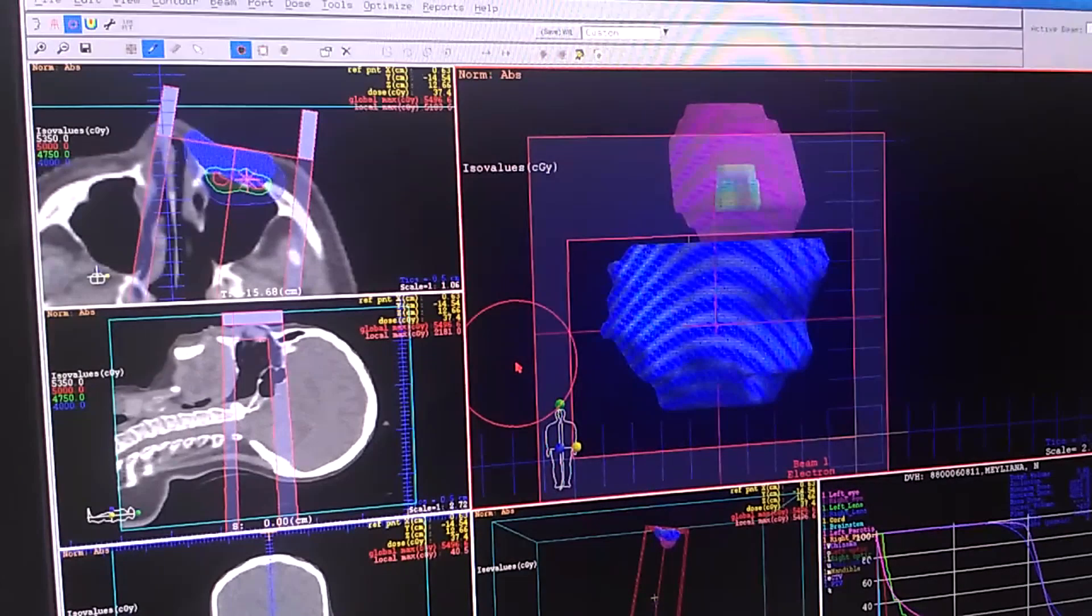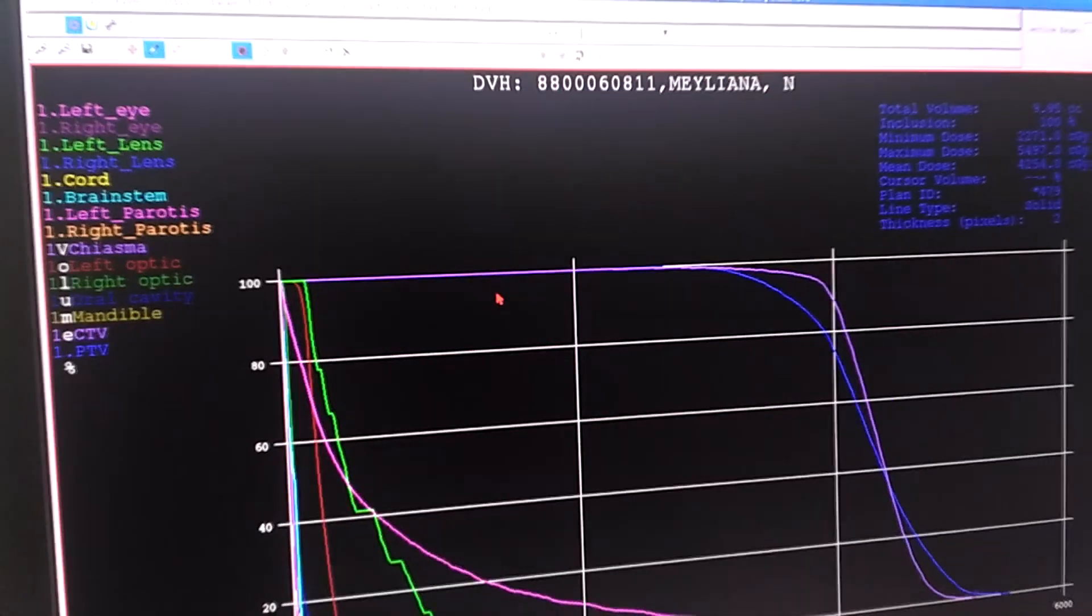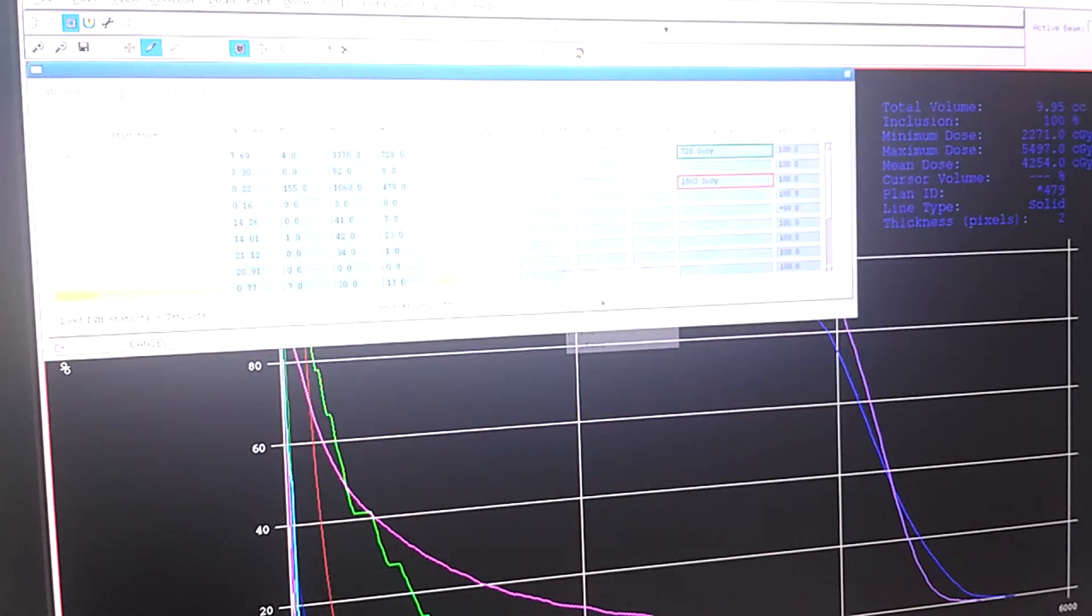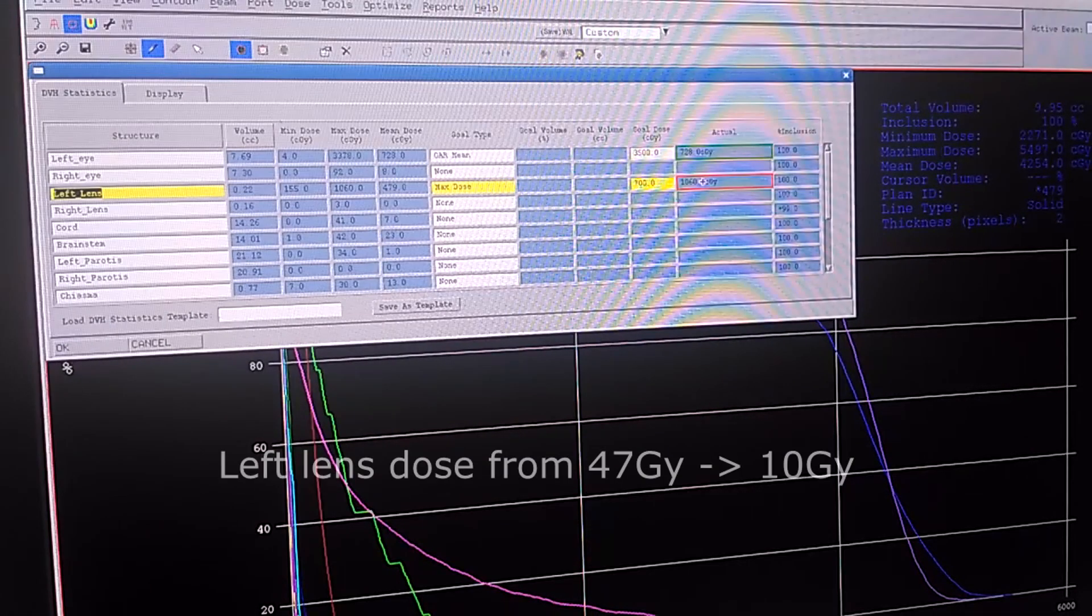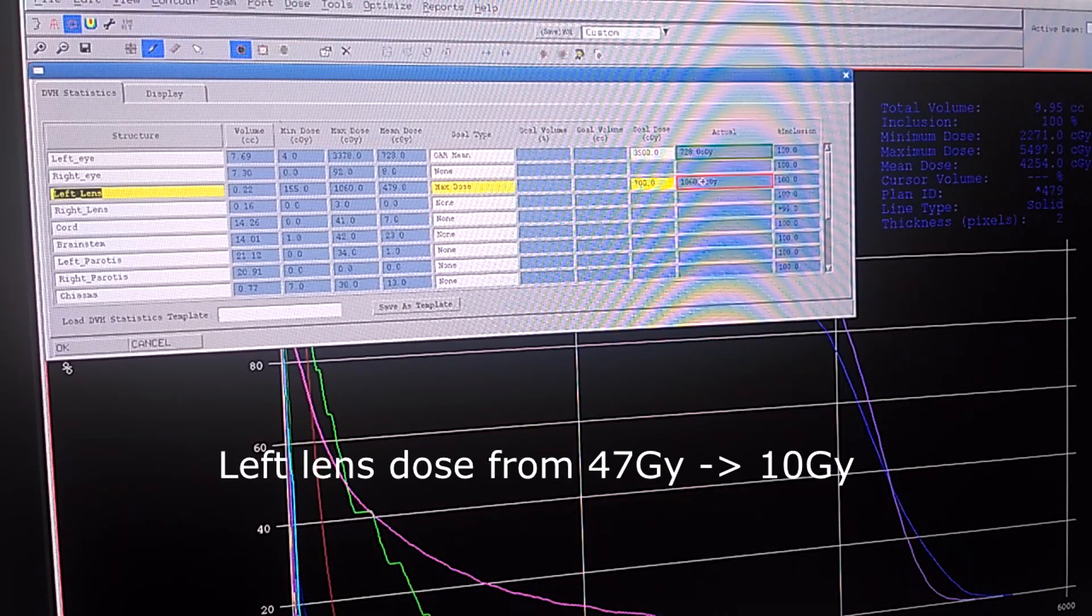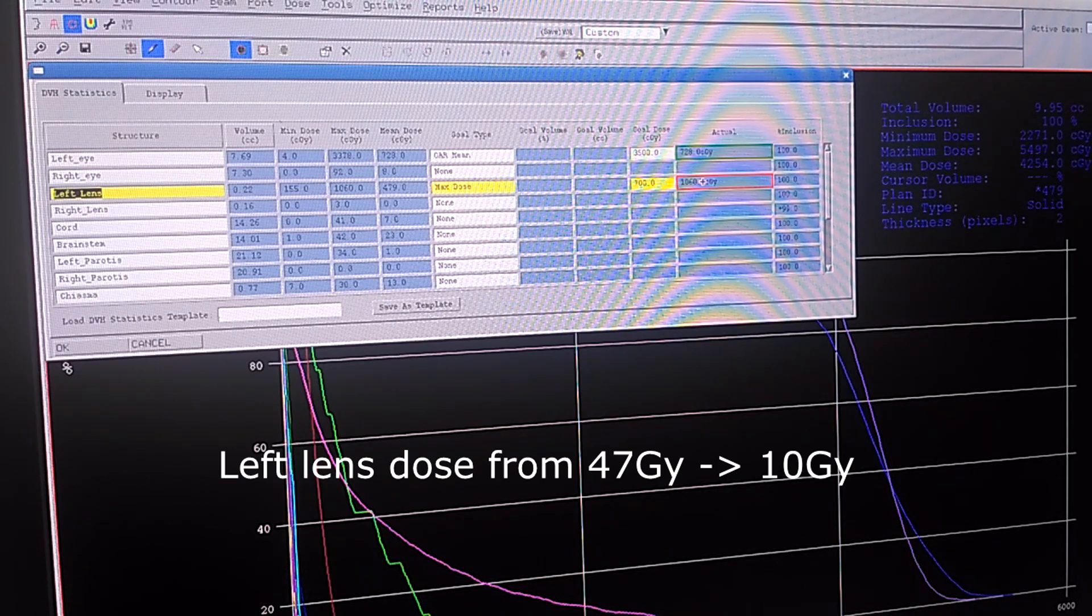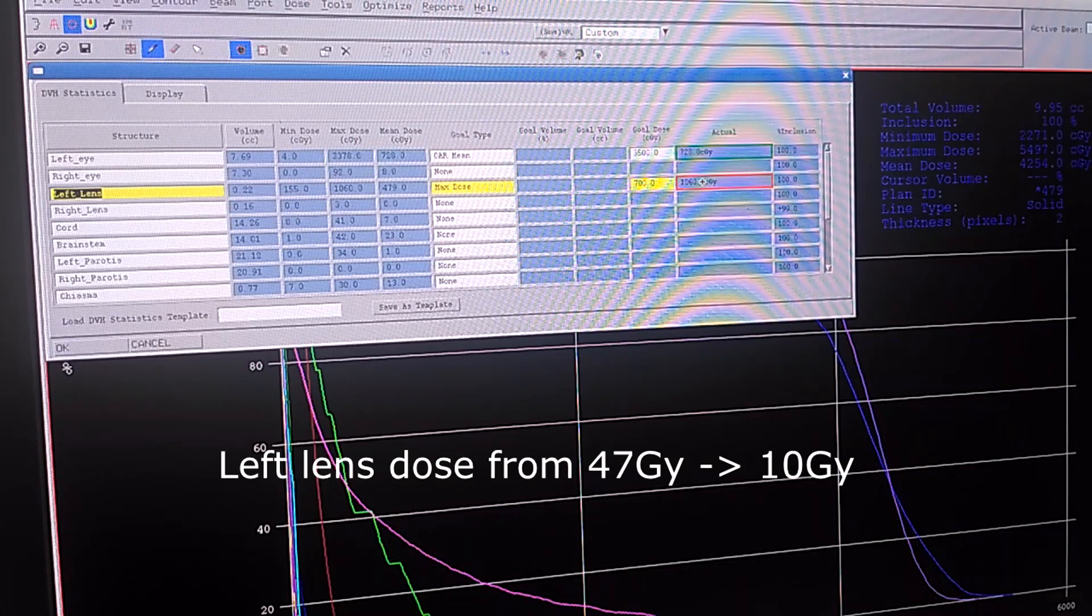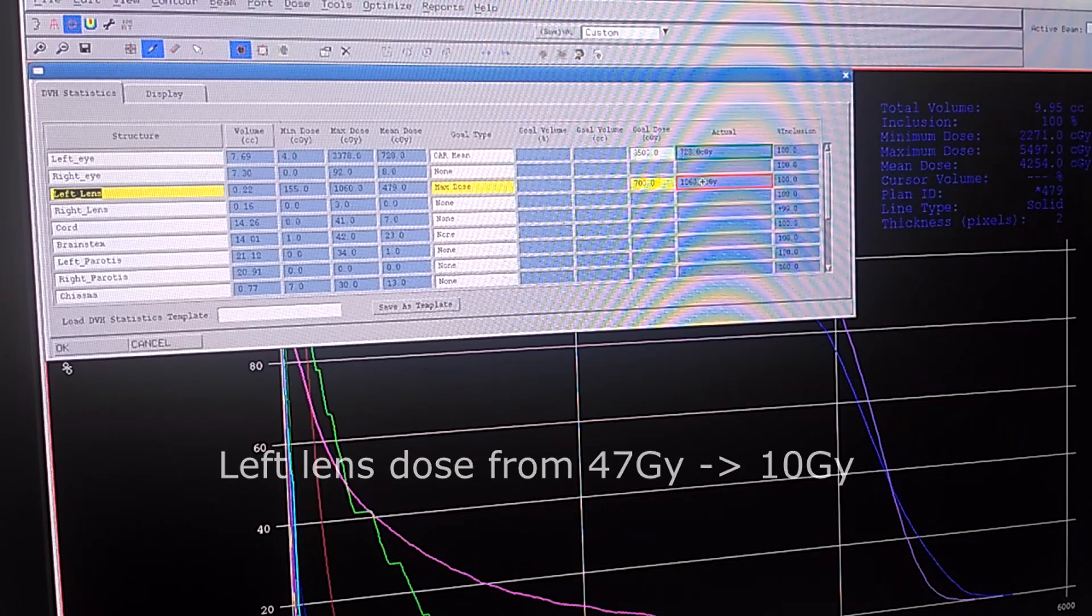After that we're going to analyze again. Before, the left lens was 47 gray. Let's see, so it's only 10 gray. This is not really good but you get the point. We make block to lower the dose in the organ at risk.